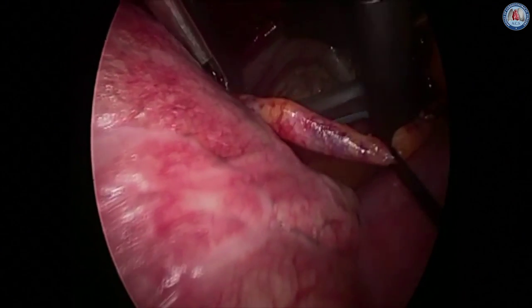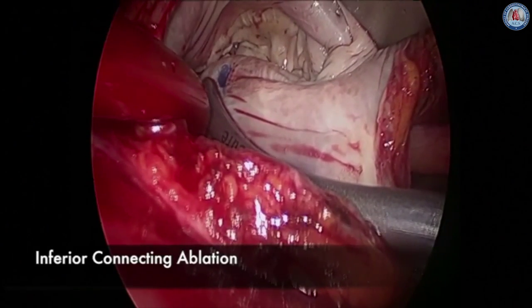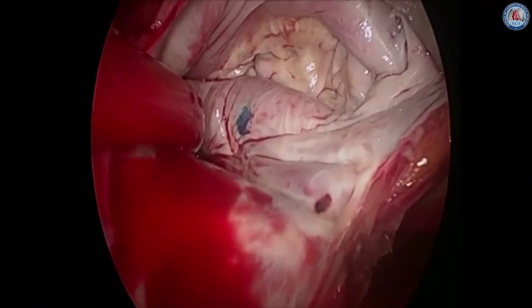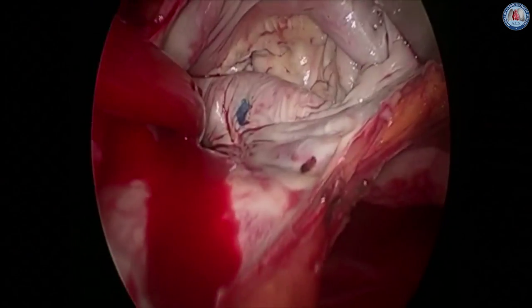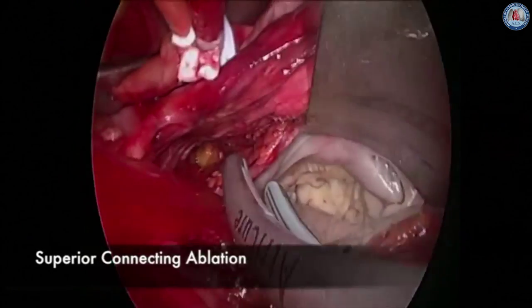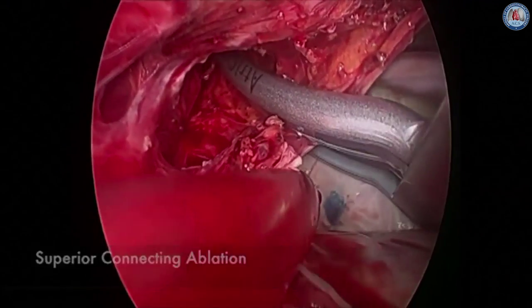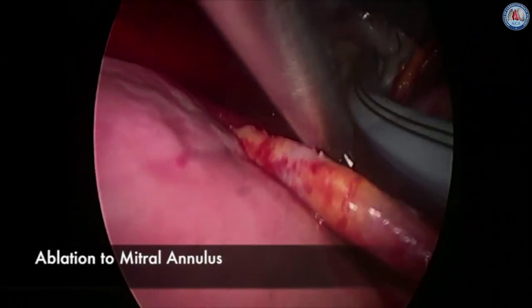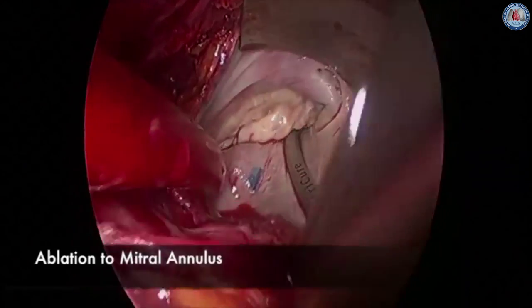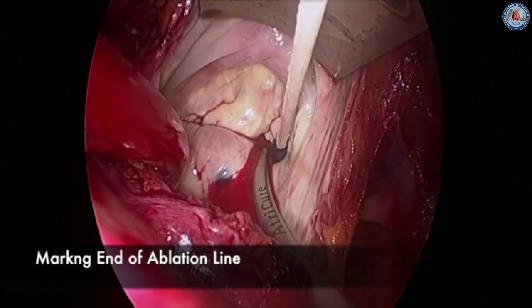The bipolar clamp is then used to create an ablation line from the inferior aspect of the left atrium down toward the left inferior pulmonary vein. The distal aspect of this ablation line is marked with methylene blue. The clamp is fired two or three times for each ablation line. A second ablation line is then taken from the superior aspect of the left atrium through the transverse sinus and down toward the mouth of the left superior pulmonary vein. This ablation line goes over the roof of the atrium. A final ablation line is created from the inferior aspect of the left atrium down toward the mitral valve annulus, and again this is marked with methylene blue.